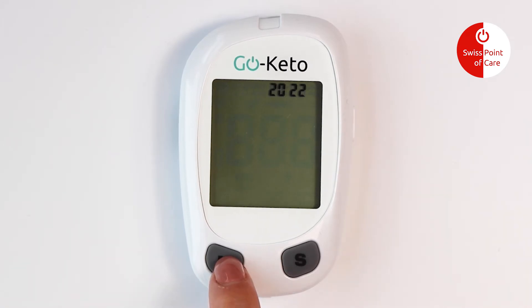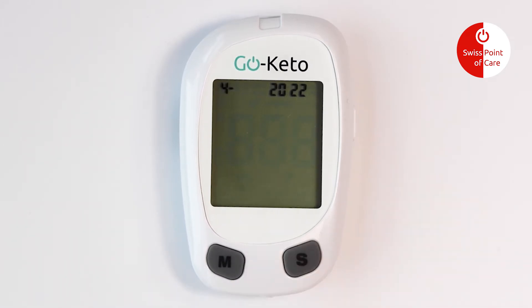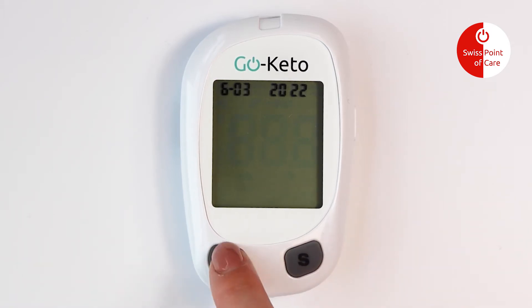Press the M button to adjust the year, and then press the S button to save your choice. Use the same steps to set the month, day, and time.